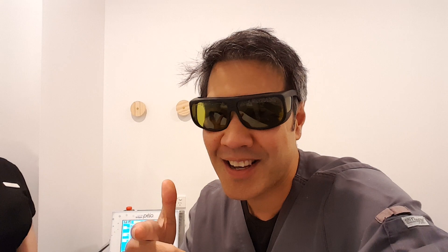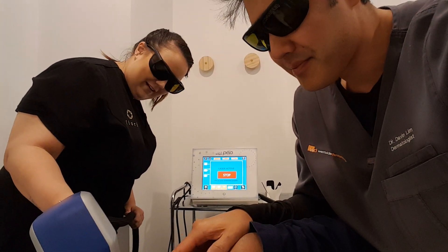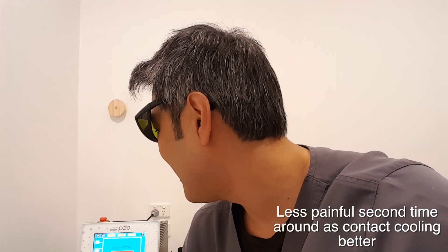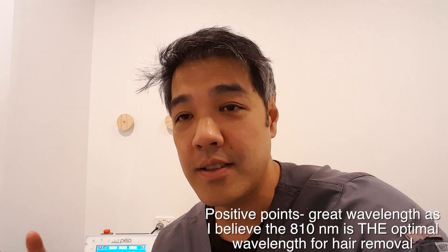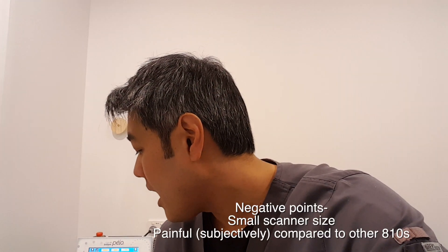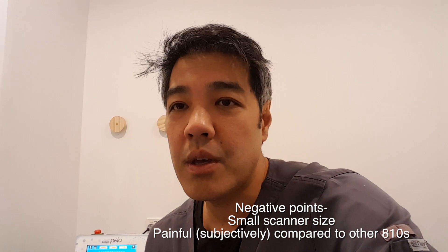Clear and Brilliant — look, I'm just doing a review on the pain scale. Let's do it again. Three, two, one. Oh, okay. Pretty catchy. It's high fluence — 18 joules per centimeter squared, pulse duration 30 milliseconds, one degree cooling. Out of all the lasers I've had, I think this one hurts the most, and I think it's purely because of the sapphire cooling — it's a very old cooling system. But if you exclude pain from the equation, it's still a very safe treatment.